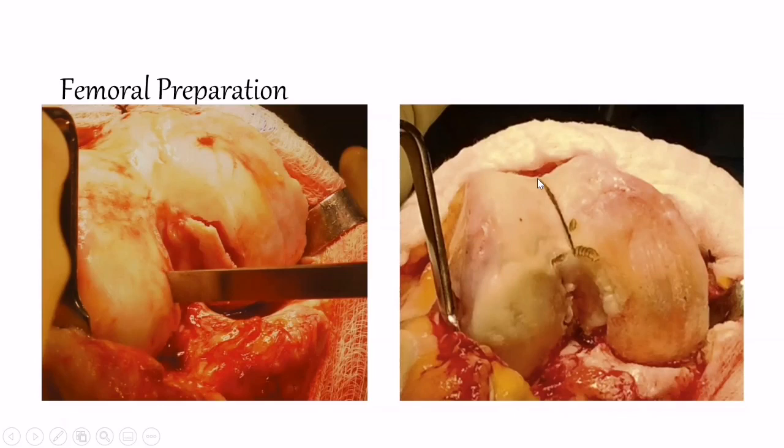And if you remember, the Whiteside line is from the lowest point of the trochlear sulcus to the uppermost point in the notch. And here is what you see, the PCL origin. This is the medial and this is the lateral. This is the medial and this is the PCL origin. And you evaluate 10 millimeters from the origin of the PCL at the femoral attachment to this point, which is 1 or 2 millimeters just medial to the Whiteside line.